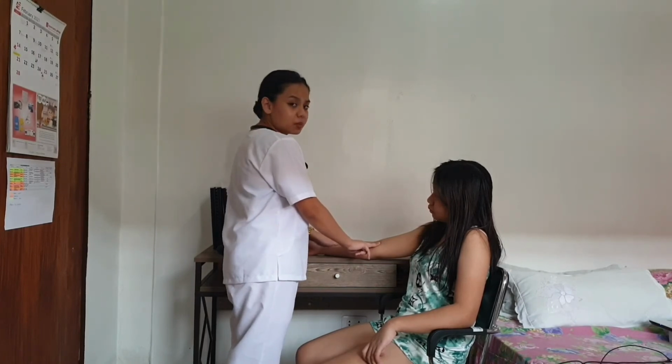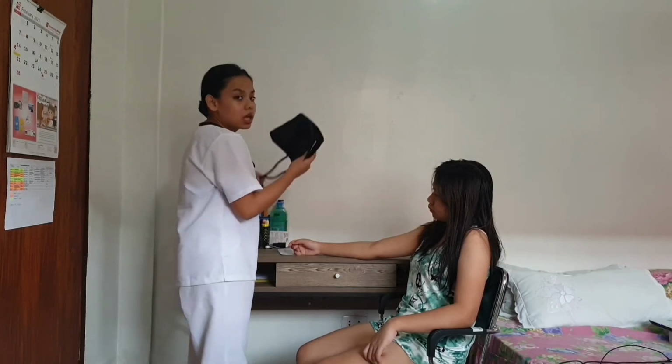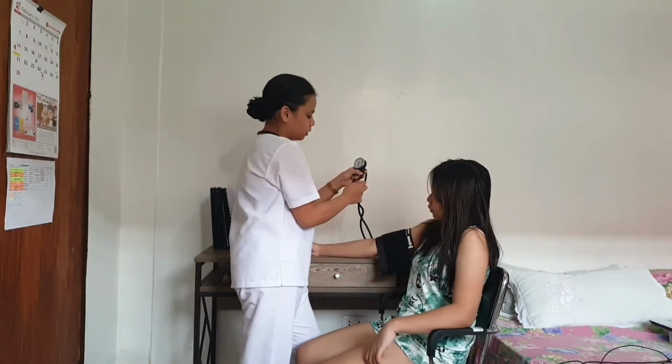Since this is the initial assessment of my patient, I am going to perform a preliminary palpatory determination of the systolic pressure. So I won't be using this yet. I will only use my sphygmomanometer.